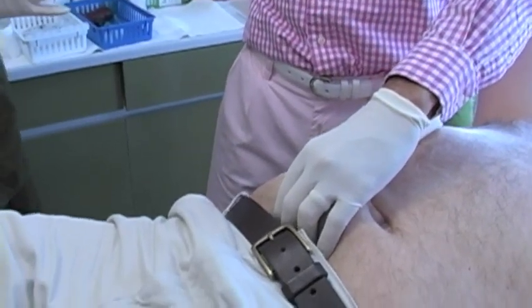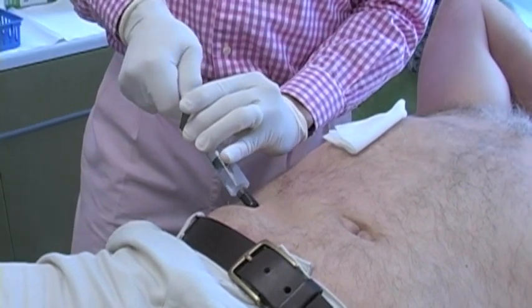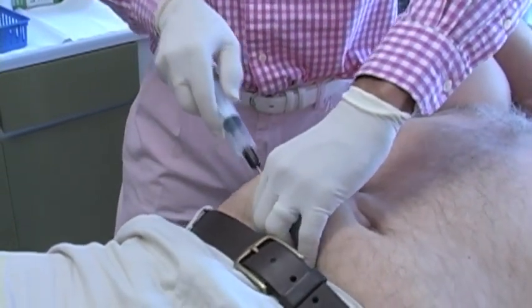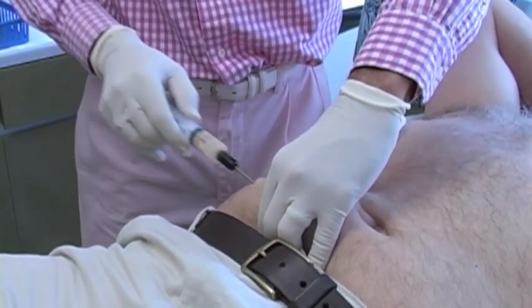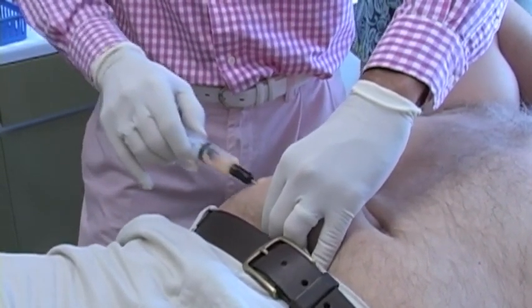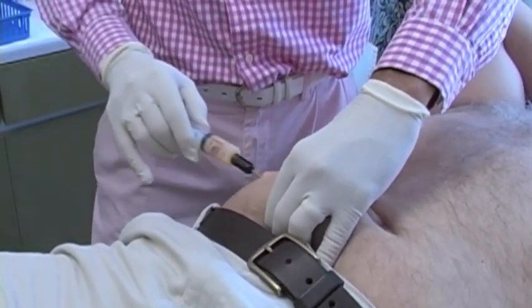I'm taking the probe and putting suction on it. You'll see that the fat or adipose cells will then go into the syringe, and that's what you're going to use as the prolotherapy solution.